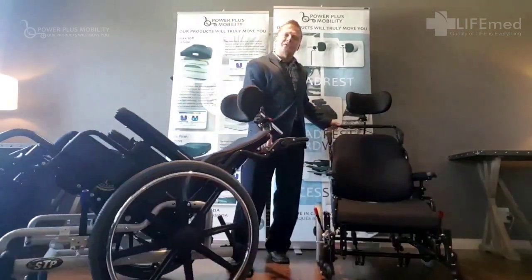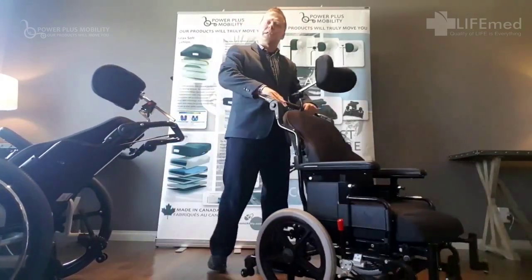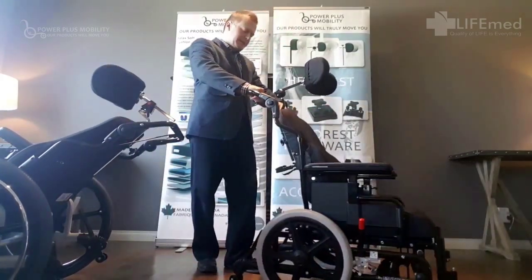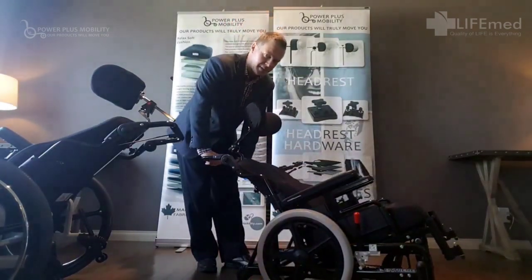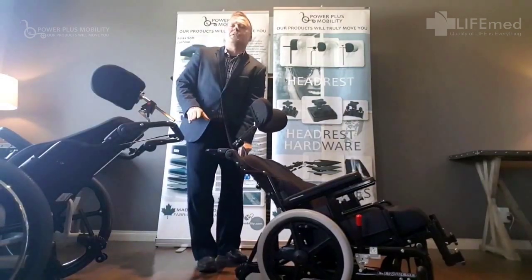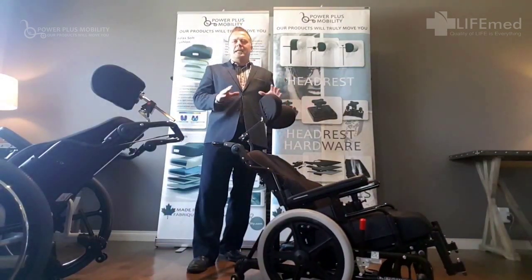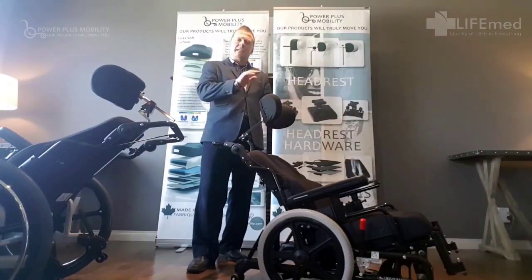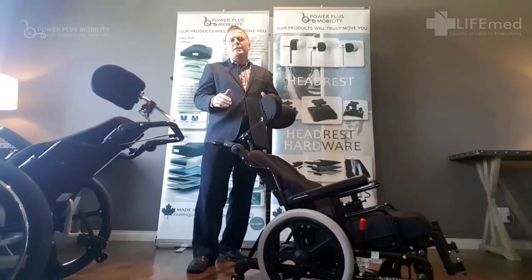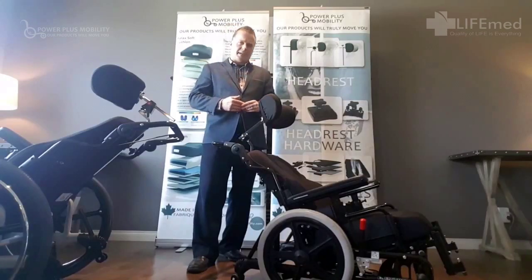The chair here on my left is the Extreme Tilt. It's designed more for foot propellers who need to get a very low seat-to-floor height and need to be safe. When we're talking about fall prevention, the Extreme chair is probably one of the safest chairs on the market. We've got an eleven and a half inch seat-to-floor height even when we're in tilt, so our clients are going to be able to get that heel strike they need to foot propel, and we don't have to worry about them wandering out of their chair or falling — and there's no need for restraints.